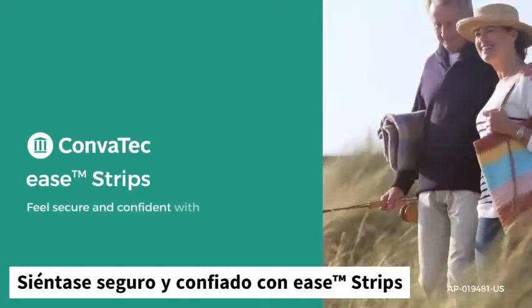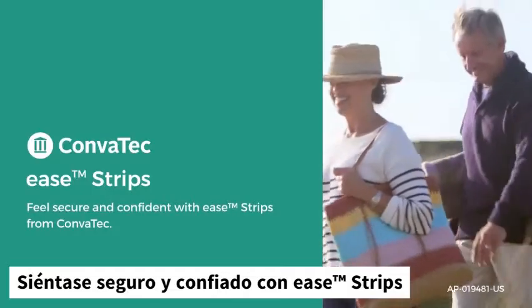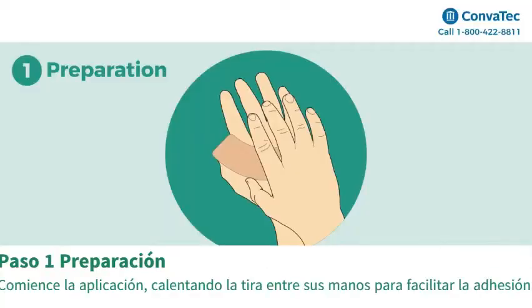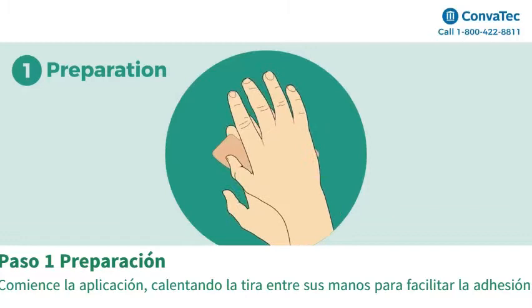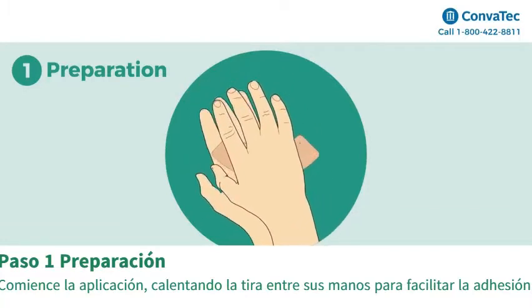Feel secure and confident with Ease Strips from Convatec. Step 1: Preparation. Begin application by warming the strip briefly between your hands to aid in adhesion.